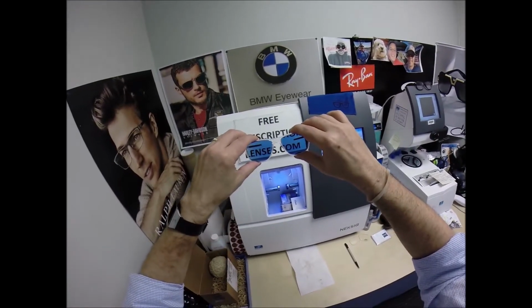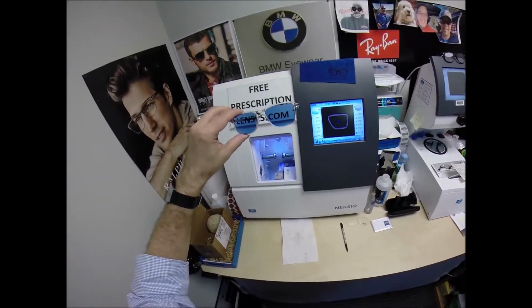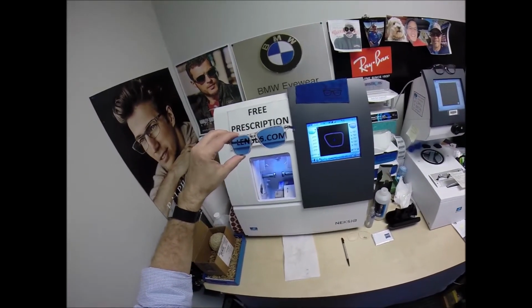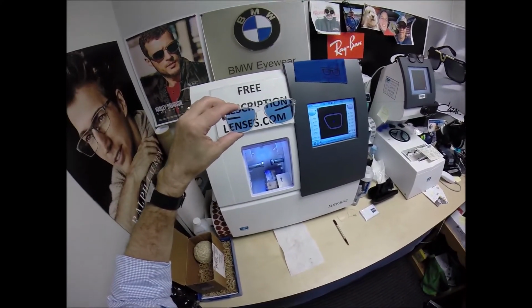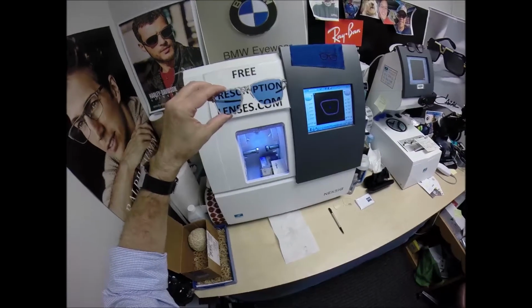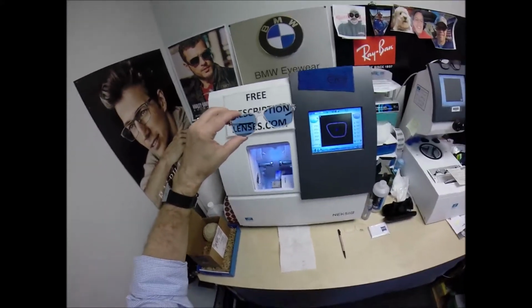But the other thing I was going to mention, all photochromic transition lenses are temperature sensitive, meaning they will get darker when it's 85 and below than they will when it's 95 and above. But I remind everyone, when it's 100 degrees outside, you're miserable, they're miserable. Nobody works 100% when it's 100 degrees outside. We all work much better when it cools off.